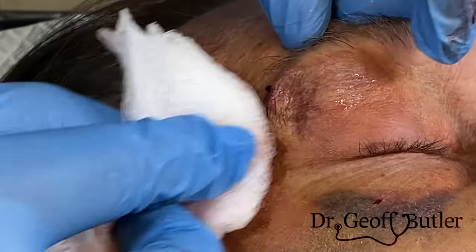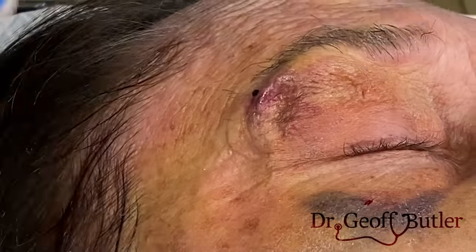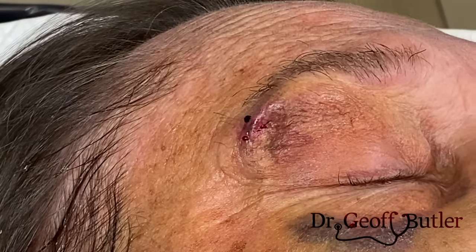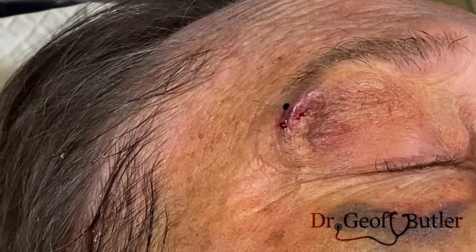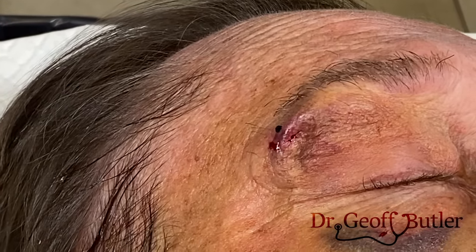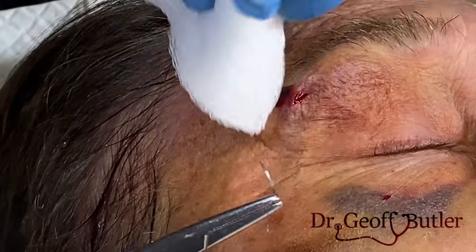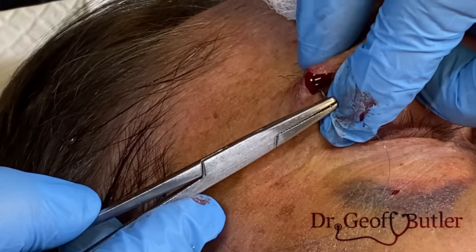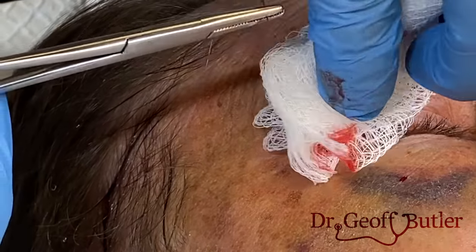That looks pretty good. You can see how that swelling is down. Now we're just going to put in a couple of stitches. There are various types of non-absorbable stitch — could use nylon, could use prolene. A couple of studies have shown that nylon has a little bit more of an inflammatory effect, so in areas like the face in particular, I want to minimize that as much as possible. So I prefer prolene, which is this material here.